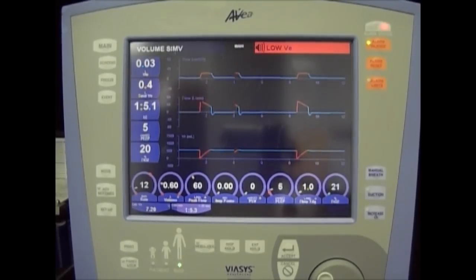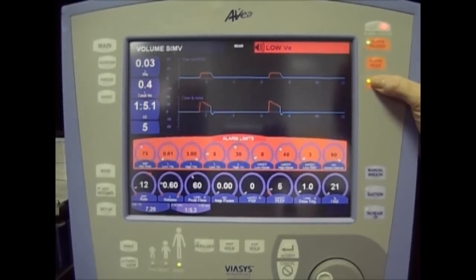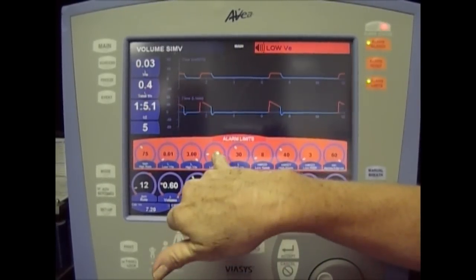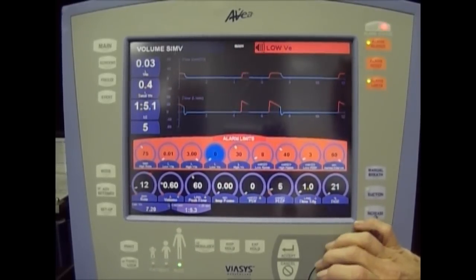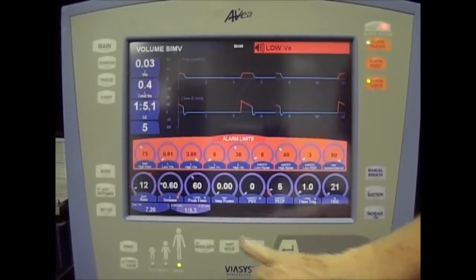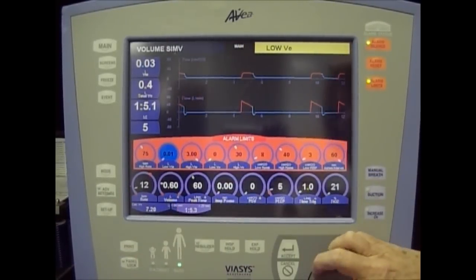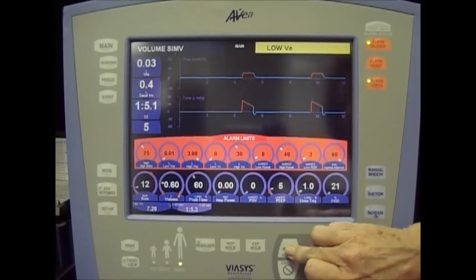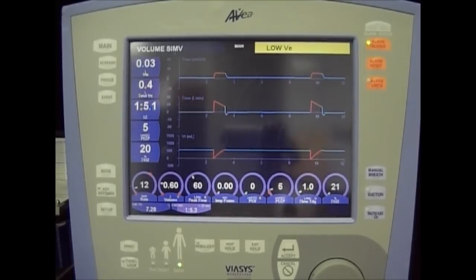After placing the EVR on the expiratory port of your ventilator, go into your alarm limits, go to your low minute volume alarm, turn that to zero, hit accept. Then go to your low tidal volume alarm and turn it down to 10 cc's, hit accept. You will no longer get your nuisance alarm, and your low tidal volume alarm will act as a disconnect.